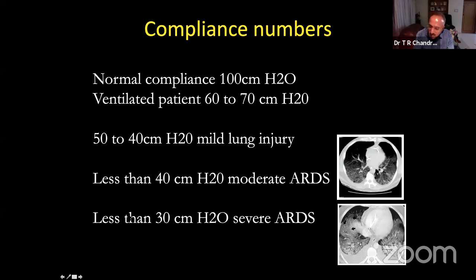They are all related. The same parameters are used to estimate every pressure, the driving pressure, the plateau pressure, your compliance, everything utilizes the plateau pressure. The end alveolar pressure is used to estimate all the pressures. So plateau pressure is important. That's why I said that is the most important button that you should know in your ventilator. See, this is knobology. Don't try to ask me where is your button. You go and find out, or call your application specialist.